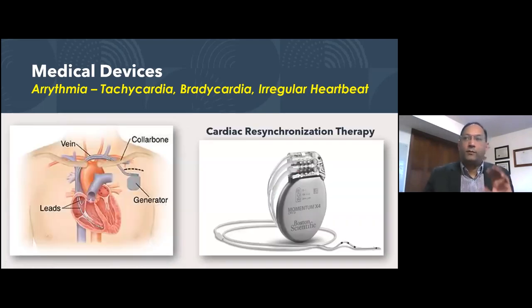One other piece that I want to talk about for completeness is what is called cardiac resynchronization therapy. It does use a stimulator, a pulse generator, but now you have actually three leads. One goes to the atrium, one to the ventricle, and one to the left side. This therapy is for the diseases around heart failure, so that you can pump the heart appropriately from all ways. You need three leads to be implanted. So cardiac resynchronization therapy is kind of the latest in the evolution, but it's still about 15 years old, okay? And these have gotten much more, this pacing at different parts of the heart.